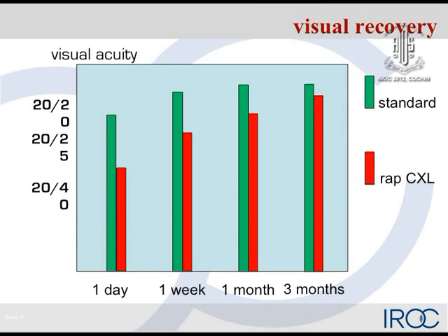I tell you, I couldn't lift that flap anymore. I had half an hour. I worked hard to lift that flap, and I didn't accomplish it. I gave up after all. You cannot lift those flaps anymore, because obviously due to that cross-linking effect, you create new layers or connections between the flap and the underlying wound, which of course provides better biomechanics afterwards.